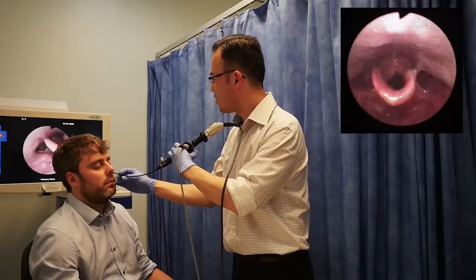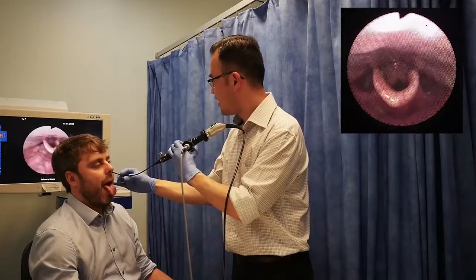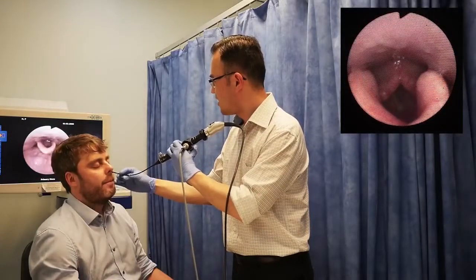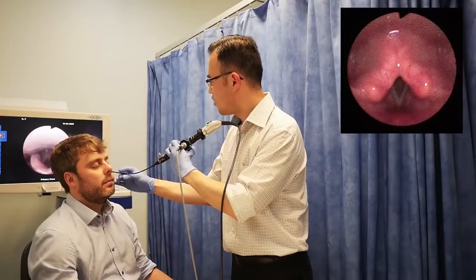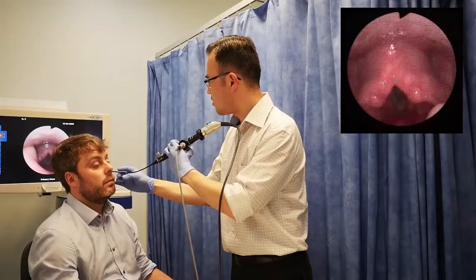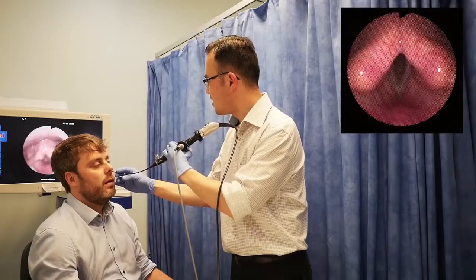I'm going to look as well on the left and onto the right. I'm going to ask Phil just to stick out his tongue, and that opens up the vallecula. And put your tongue back in. I'm just going to ask you to say E. E. Yeah, that's good. Looking very normal. Checking for cord mobility. And I'm just going to approach a bit closer now, trying my best not to touch any structures, as that could cause a cough or a gag. And say E again. E.